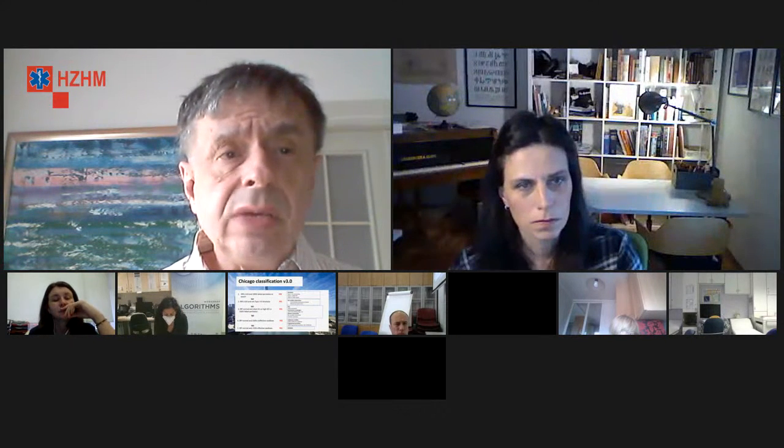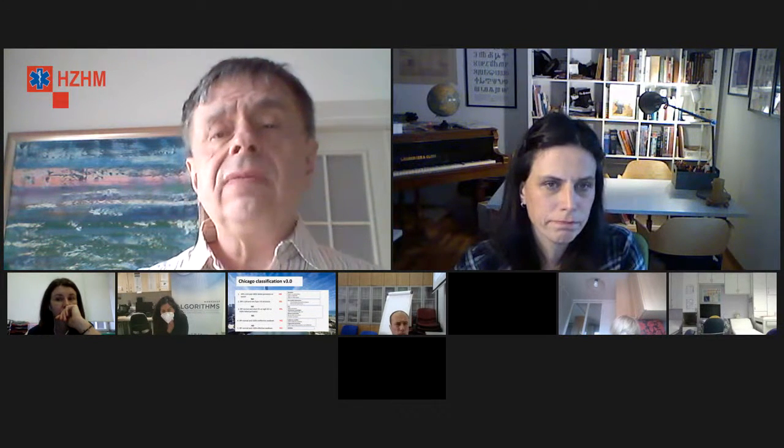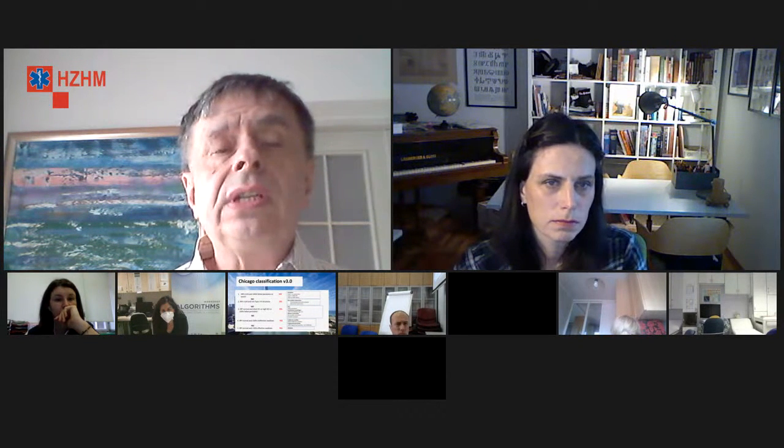Pa ako je uređaj objavio da ne bi bilo prihvatljivo, treba dobro razmisliti da li to stvarno nije prihvatljiva vrijednost. Ja zbog toga uvijek radim i rezervne gutljaje. Dakle, nikad ne idem na 10 gutljaja, idem na 12-13 gutljaja, jer uvijek se može desiti kod patologije jednjaka da vam računalo sugerira da nešto nije uzeo u obzir. Bolje imati 10 gutljaja, naravno, čistih, ali nekad sam zadovoljan i sa 7-8 gutljaja. Ako mi 6-7 gutljaja izbaci iz nekog razloga, onda vidim da li neki od tih gutljaja mogu uzeti u obzir, i onda to uzmem u obzir.